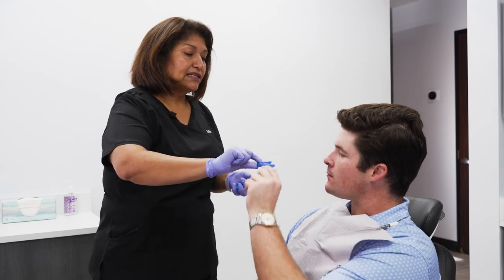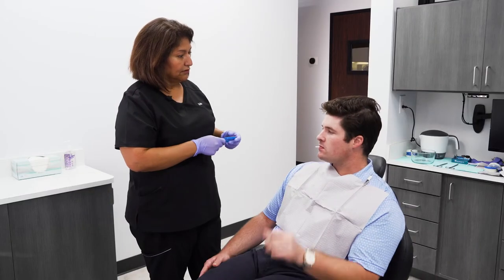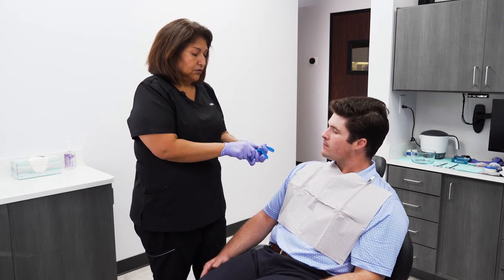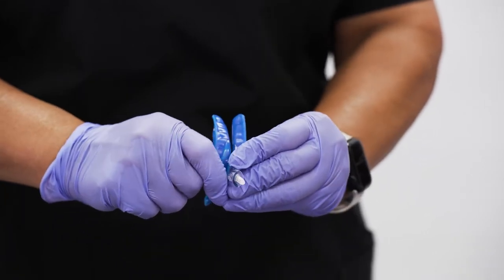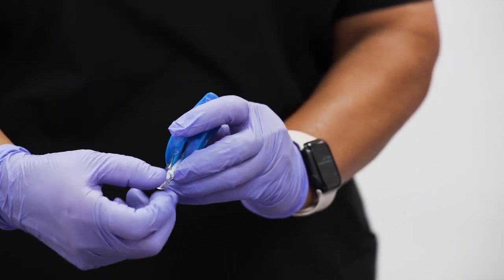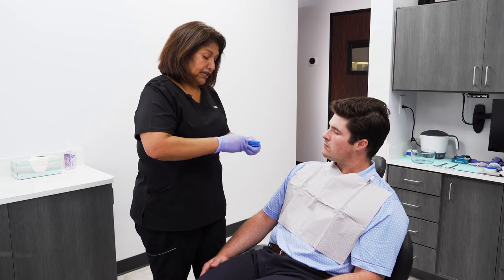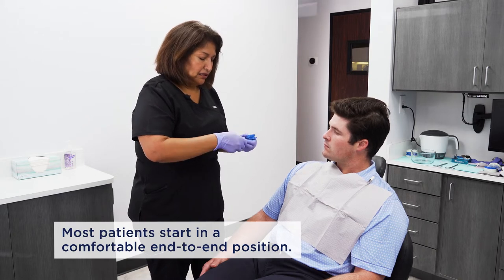The lower one is the one with the adjuster. Same thing — you just want to place this right over the teeth and just kind of bite into it. We're going to connect the two by sliding the adjuster into the clear post at the top here, and we're just going to set it right about that position, and then use the dial here to set it all back together. Now what you're going to do is place this on together, line it up between the teeth, kind of bite end to end, and then just snap it into position.